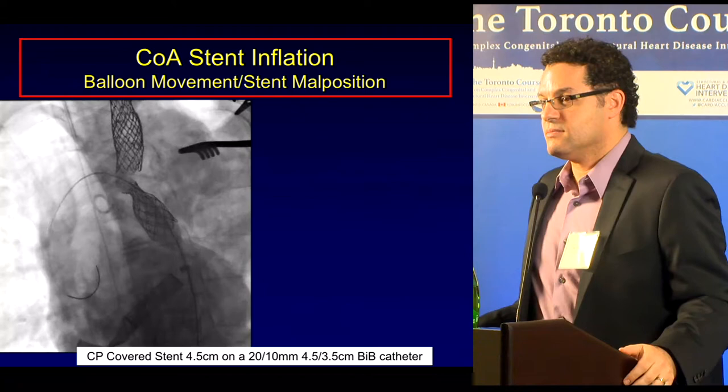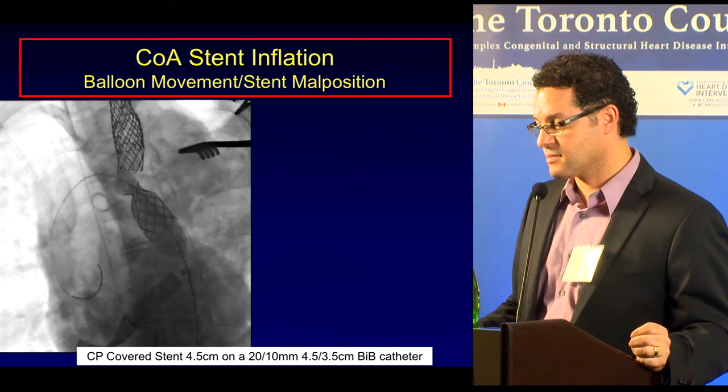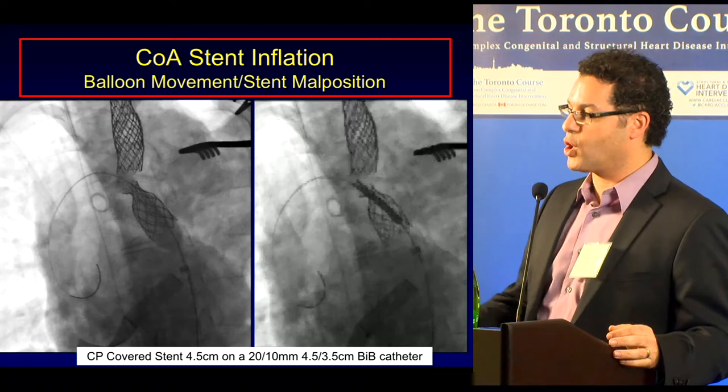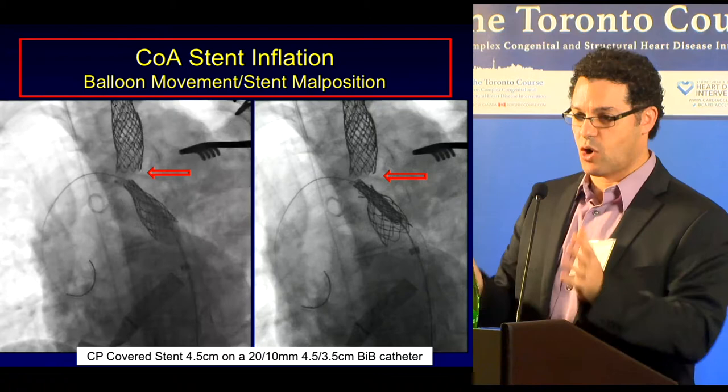So this is the first covered stent going in from below. On the inner balloon, what you couldn't see was how much it moved down, but I was trying to avoid jailing the left subclavian completely. So this was now another CP stent, a second one inside the first. Now we're willing to go up a little higher, and we figured if worst case scenario we're not fully occluding, we can go up around it and curve the softer platinum stent around the arch and open up into the subclavian if we have to. You use two balloons, one into the subclavian and the other around the arch, to open it that way. So this time it opened.